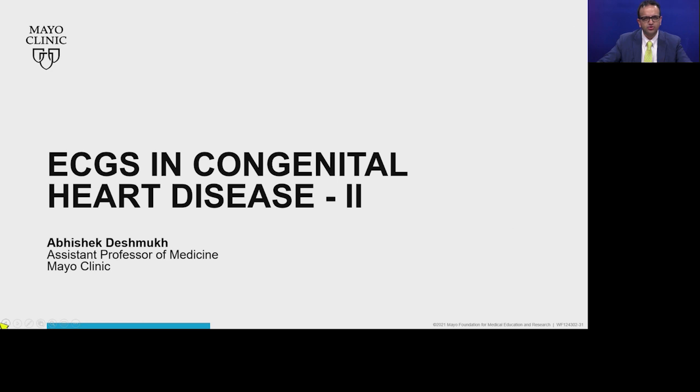Today I'm going to talk a little bit about specific ECG patterns in certain specific congenital heart disease. So this is part 2 of our series. In the first part, we talked about predominantly atrial septal defect. And here we'll talk about few other specific lesions.